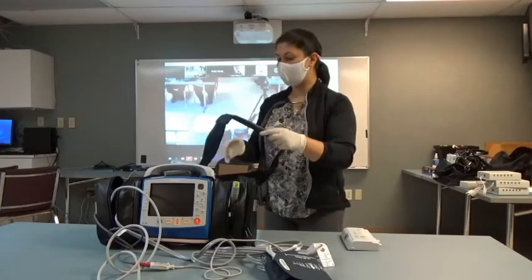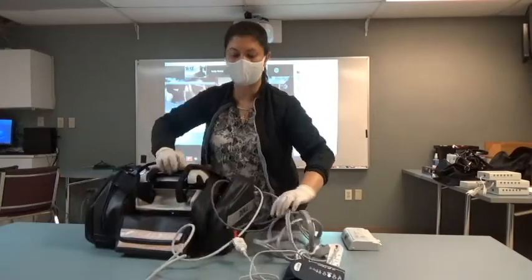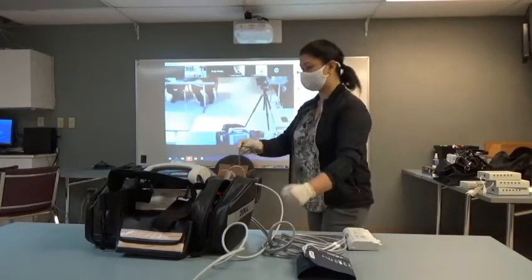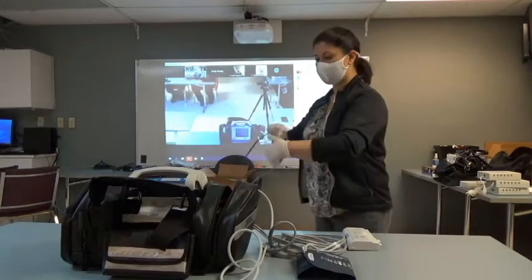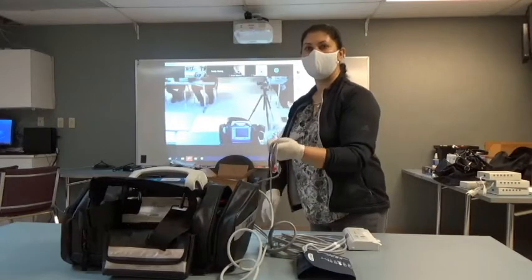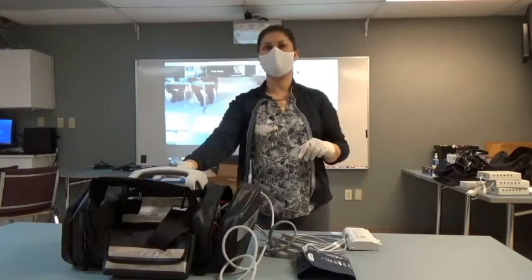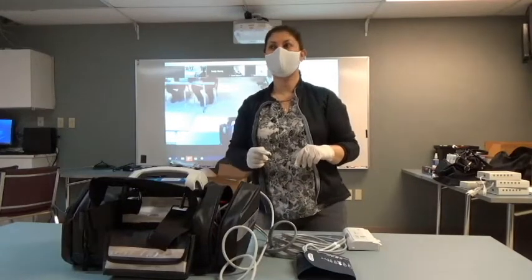Okay, so for those of you who have never used this device before, let's turn this around so you guys can see your screen. And I'm just going to clean up a little bit here. All right, let's make this a little easy. The green button up at the top is your on-off button. Everything on the right-hand side has a picture on it.